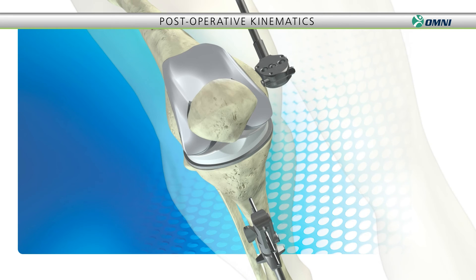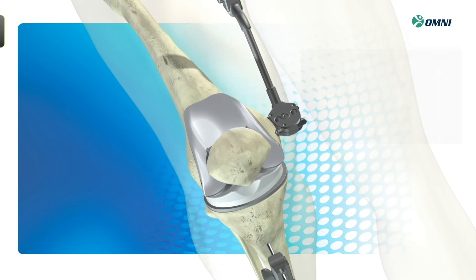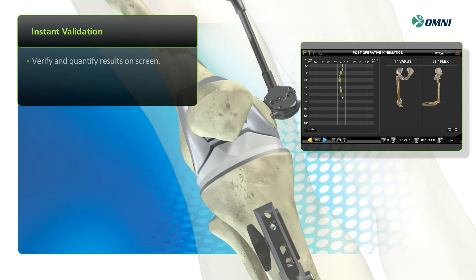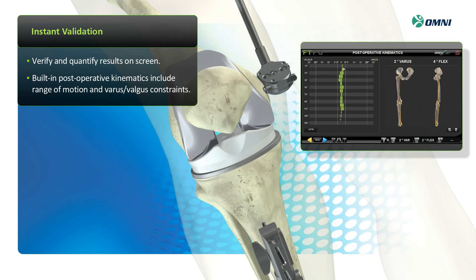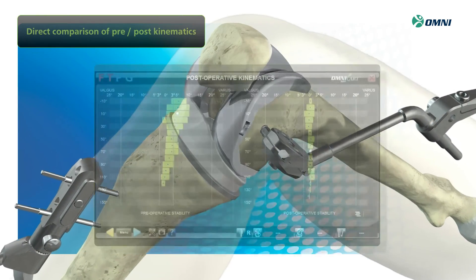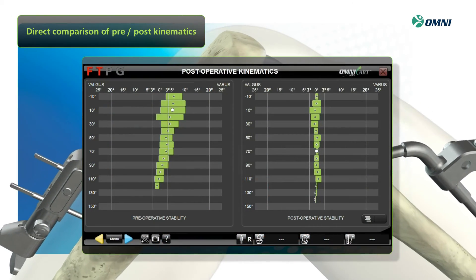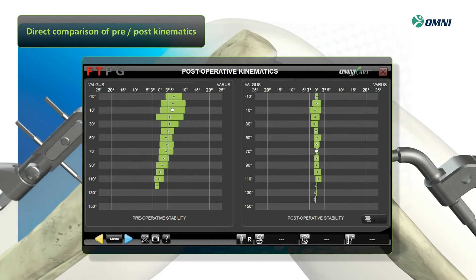Once implants are in place, you can verify and quantify results on screen with the system's post-operative kinematics, including range of motion and varus valgus constraints, to ensure that your plan was properly executed. The system also allows you to directly compare pre- and post-operative kinematics to confirm proper alignment.